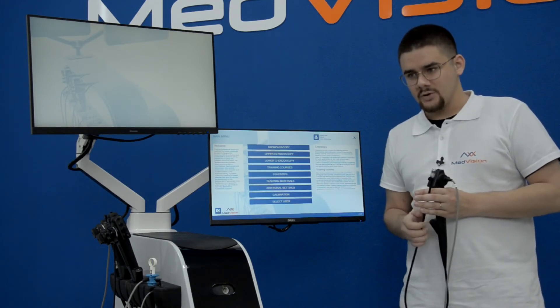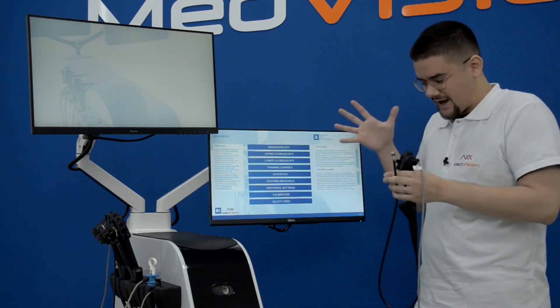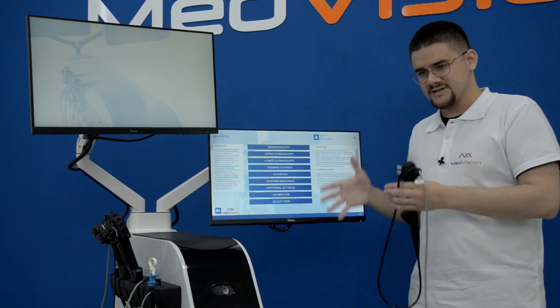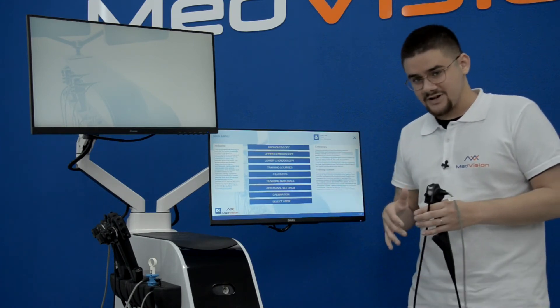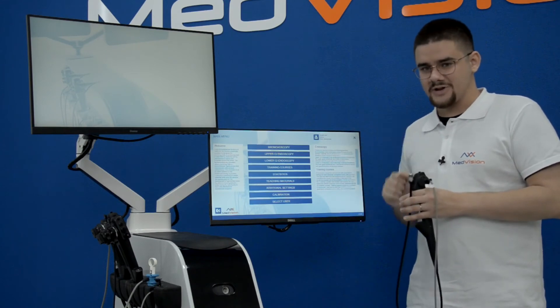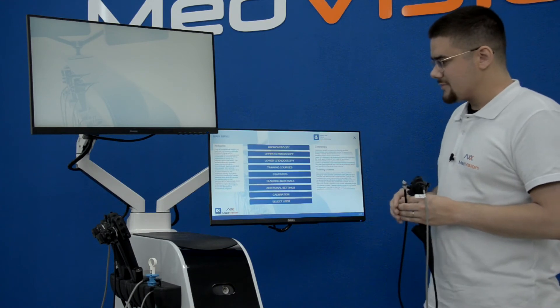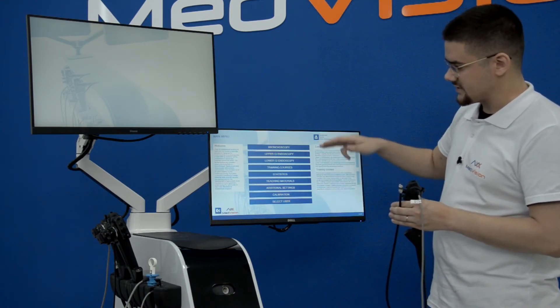We would like to note that our simulators are very similar and the philosophy in development and design is exactly the same. If you want more tips and tricks on how to use the simulator, please look at the LapVision simulator video. Going back to the menu — it is pretty standard throughout all of our simulators.